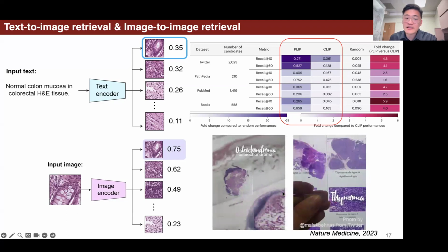And so I think image-to-image retrieval is really, really useful, especially considering that a lot of clinicians, when they make a diagnosis in a clinical workflow, may often compare their images to previous examples or cases they have gone over before. And image-to-image retrieval will be just as useful as a Google search to help you retrieve relevant previous cases, or those cases sharing similar tissue patterns or morphological patterns of the cell. So that can be really useful, right?